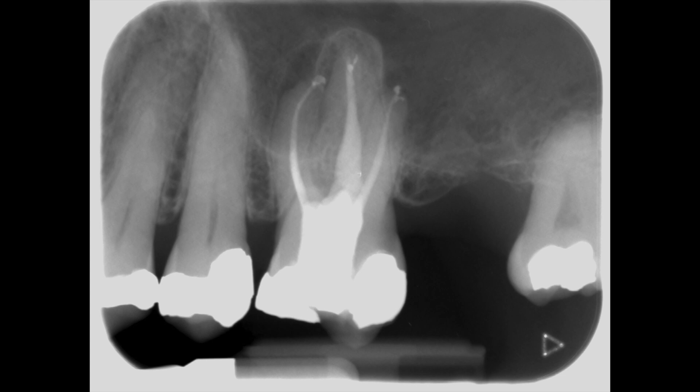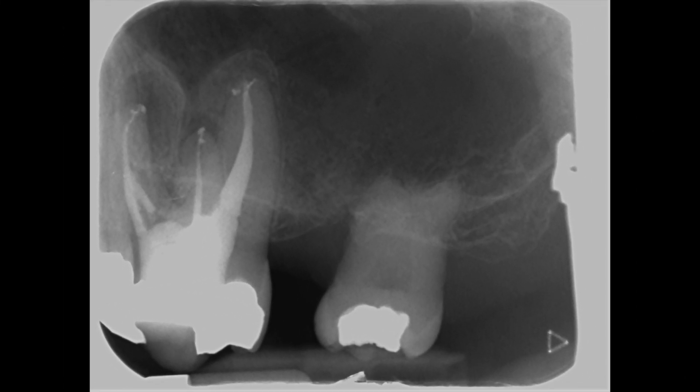The final post-operative radiograph shows a good coronal apical seal in all the root canals. There's an interesting delta at the apex of the palatal root. The repair material is not really visible. A distal angle view shows the MB1 and MB2 canals very clearly.